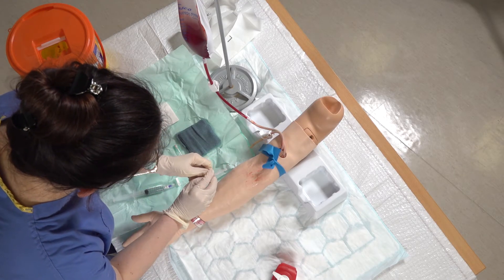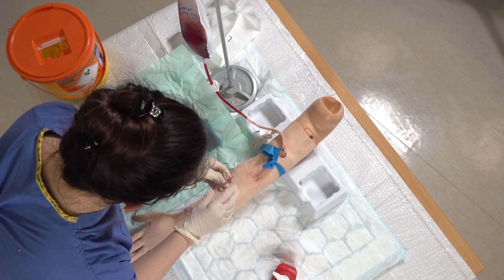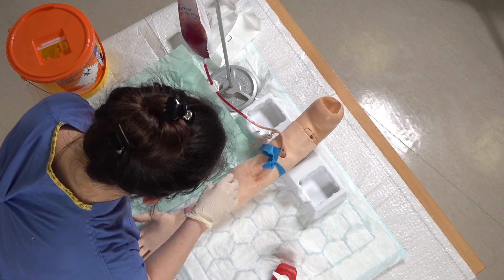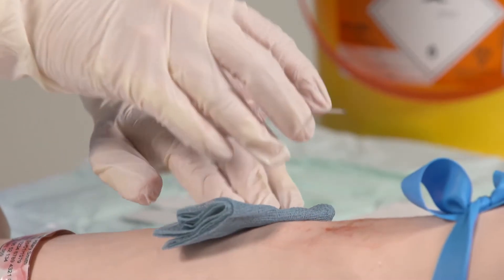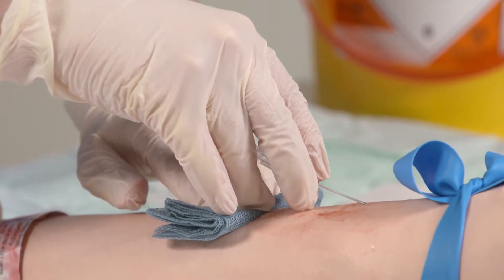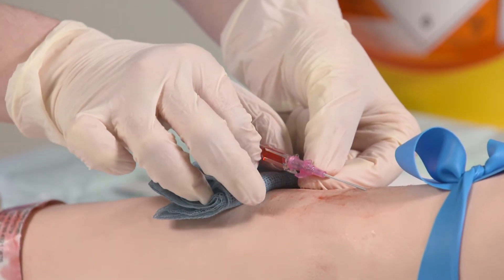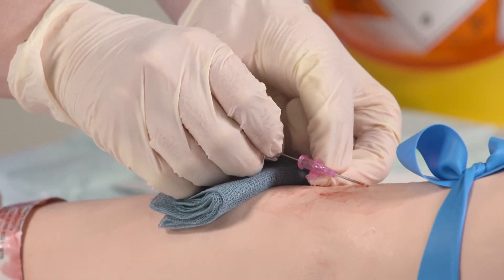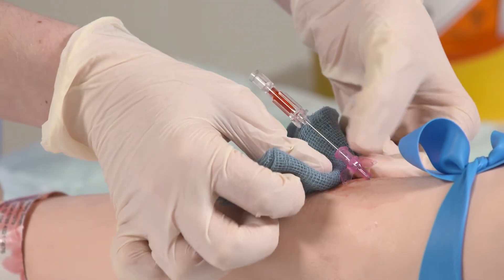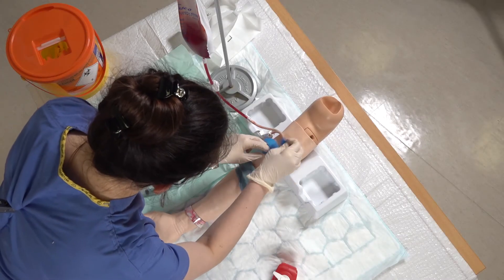Next I've got my cannula. Remove the sheath, set that down and then with my fingers on each wing, bevel up, I'm going to be doing a 30 degree angle. I'll just apply some skin traction with my other hand and then insert the cannula into the vein. I'm looking for flashback — first flashback — then withdraw the needle slightly and advance the cannula, keeping the needle at the same place. The cannula is now in, so we can withdraw the needle, put that in the sharps bin and undo the tourniquet.